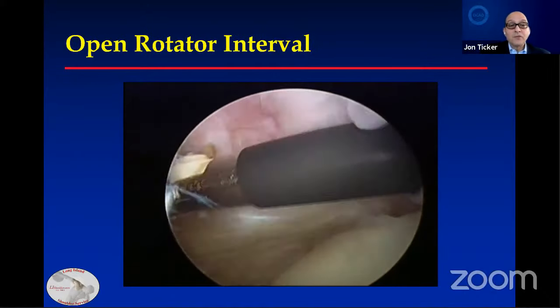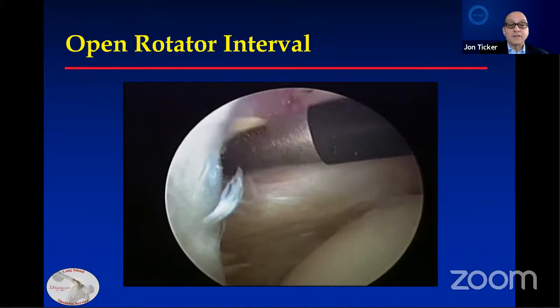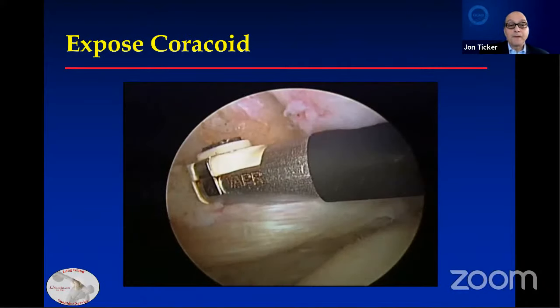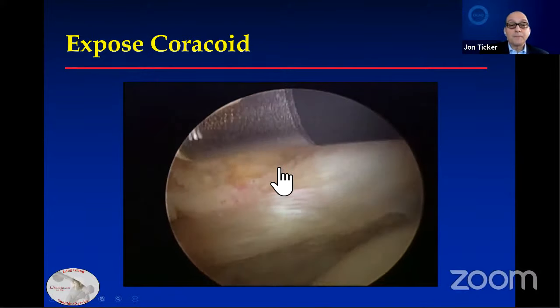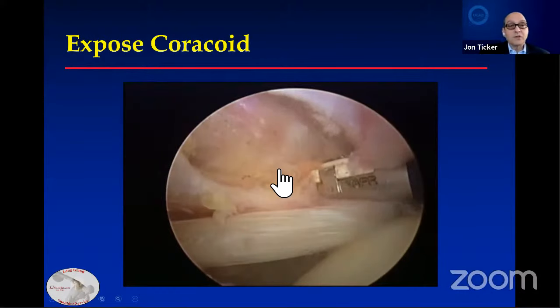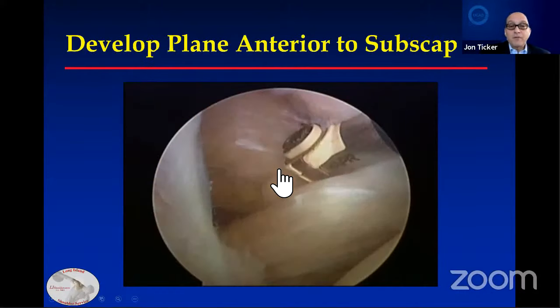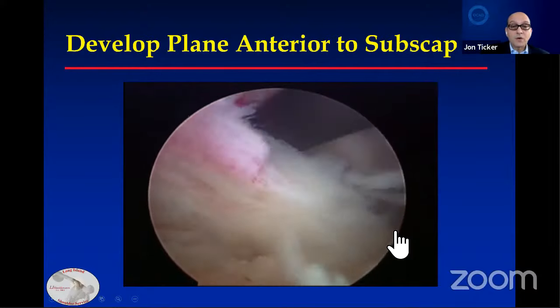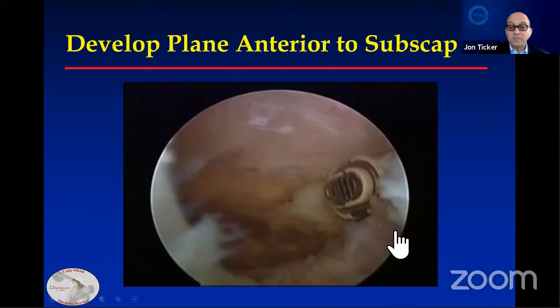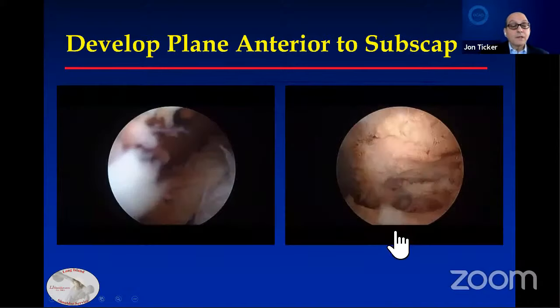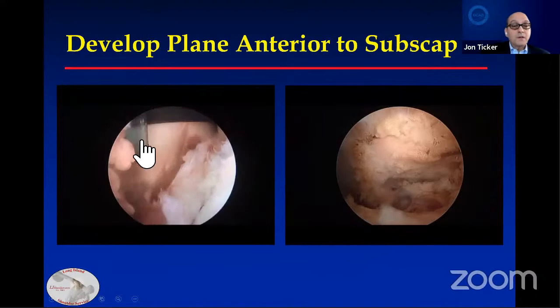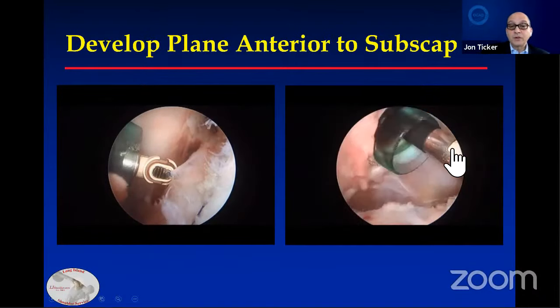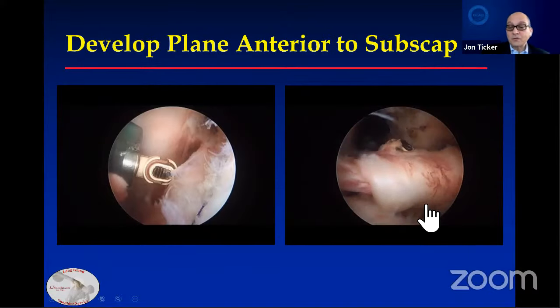You've got to remove the tissue in the rotator interval so you can work on both sides of the subscapularis. One landmark is to look for the coracoid tip, which we'll be able to see right over here. This wand helps ablate soft tissue. Then we want to make sure we have a plane — this is posterior to the subscapularis. We'll go out into the subacromial space and then anterior to the subscapularis to create a working space around the tendon. This is another patient where you can see the space anterior to the subscapularis, viewing from lateral and from posterior, with enough space to pass sutures and tie knots.